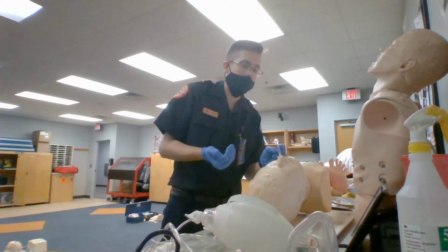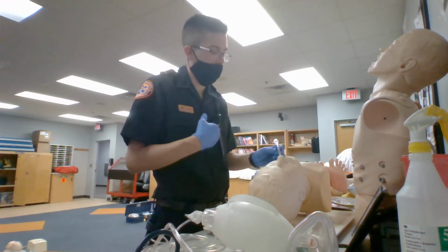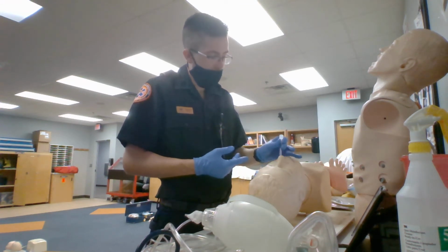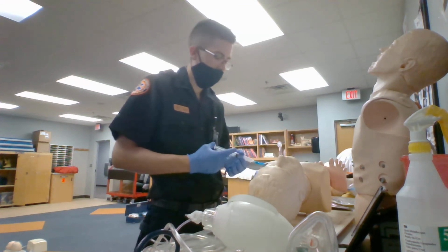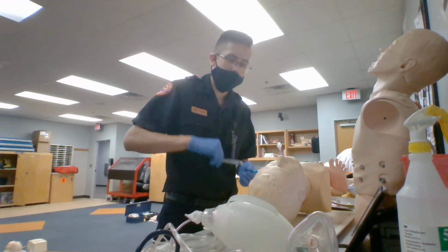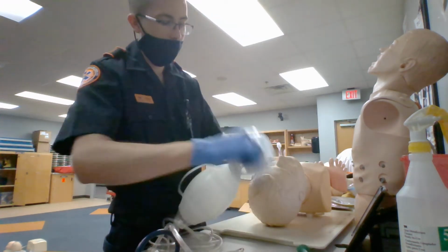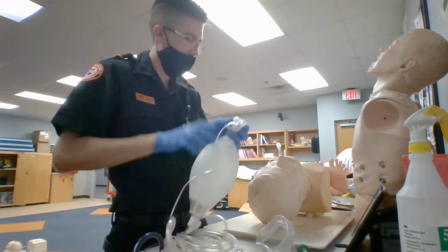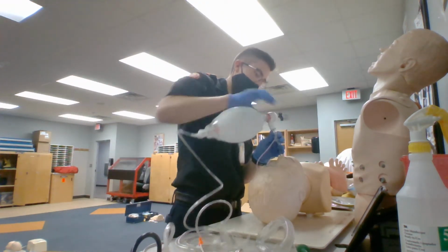All right, I'm going to try and advance these past your vocal cords, so I'm going to need you to take a big deep breath for me, okay? 1, 2, 3. Wait for that big deep breath. Advance my tubing. Inflate my cuff. Remove the syringe. Take my BVM. Attach it to capnography. Attach it to my patient.